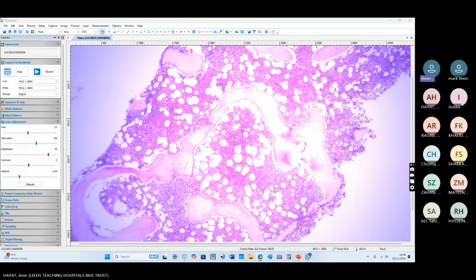So this patient has peritrabecular infiltration, the bluish part, the peritrabecular infiltration of lymphoid cells, and peritrabecular infiltration of lymphoid cells is a feature of follicular lymphoma. And this is one of the easiest trephines to diagnose in the FRC path exam. There are features of diseases that you should cram for the exam purpose.